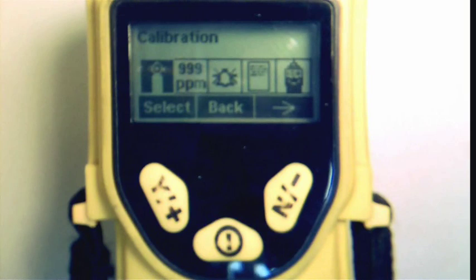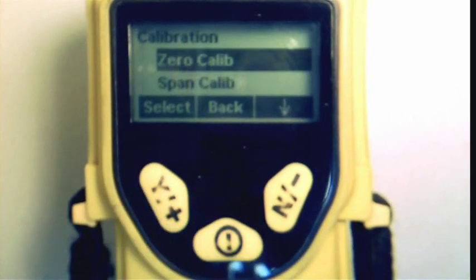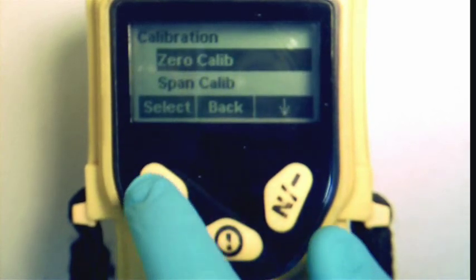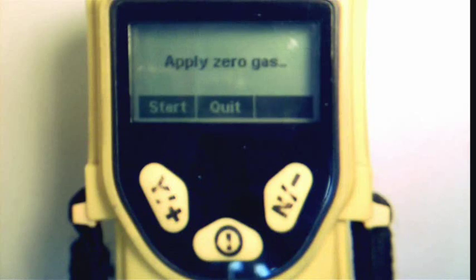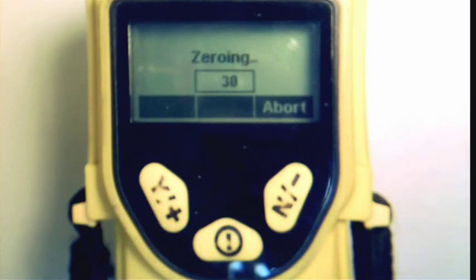To begin calibration, make sure the calibration menu is highlighted and press Y. Next, press Y again to select zero calibration. Please take a moment to make sure that you are in a clean, fresh air environment. Then press Y to begin the zero calibration. The unit will now take readings and update its calibration memory.